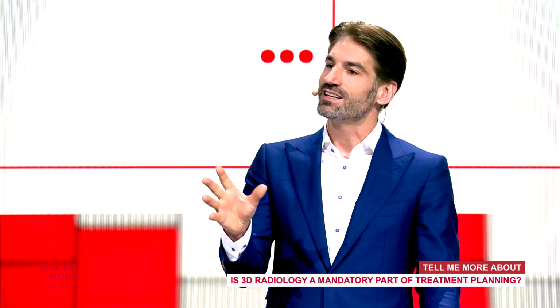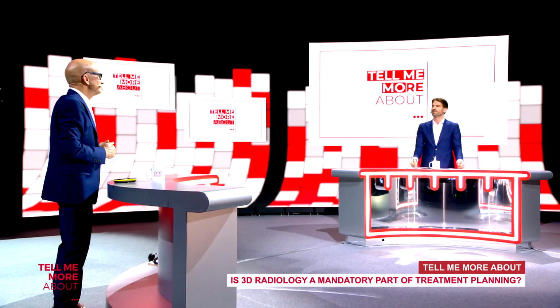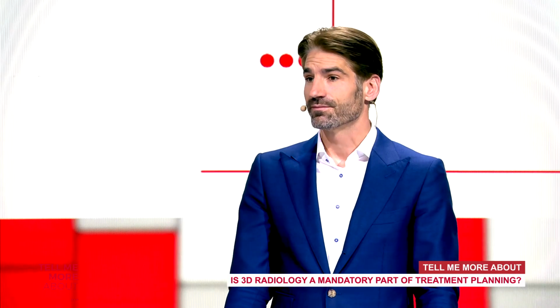Very dangerous. What can you say about the tolerances on this real-time 3D navigation? What do people need to take into account? What is your experience? You mean how much better you are with the dynamic one? Yeah. You are clearly a little bit more precise, from what the evidence shows. Maybe 1 millimeter. Still, you are still at 1 millimeter. Maybe 0.8, but it's still 1 millimeter. And this is a lot in our field.